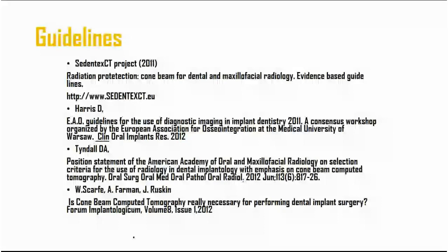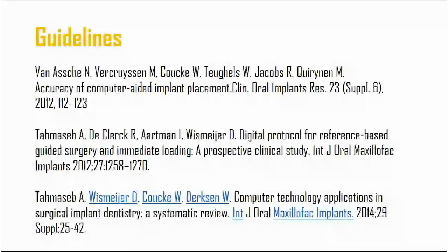The main paper is the first one, which will lead you to the general CBCT issues. And the other ones, although they are a little bit old, 7-8 years, are really important because they stress important issues about our work.